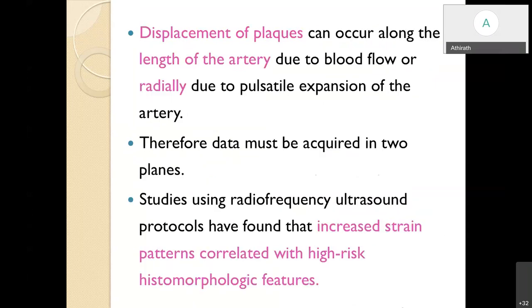Displacement of plaques can occur along the length of the artery, which is due to blood flow, or radially due to pulsatile expansion of the artery. Therefore, data must be acquired in both planes, that is the longitudinal and transverse plane. Studies using radiofrequency ultrasound protocols have found that increased strain patterns correlated with high-risk histomorphologic features.